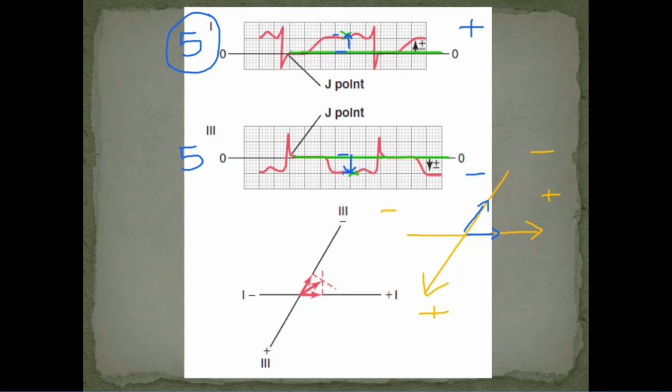First of all, we have to draw a perpendicular line from the tip of these vectors. Drawing a perpendicular line from the tip of lead 1 and drawing a perpendicular line from the tip of lead 3, the injury potential leads. And then from this zero reference line, I have drawn a resultant vector where the perpendicular lines are intersecting. So this red line is our resultant vector, which is telling us about the injury potential. How to interpret this injury potential, we'll see in the next step.